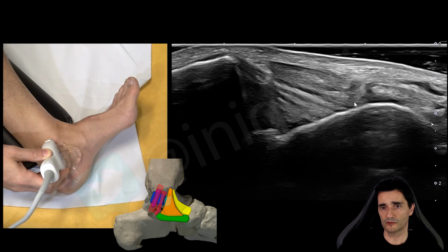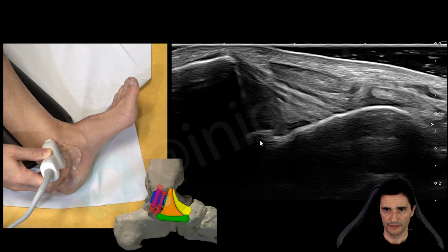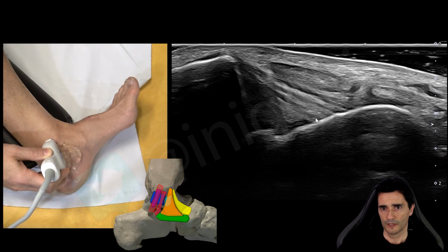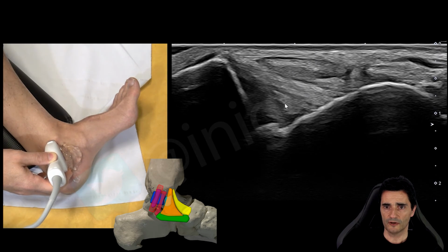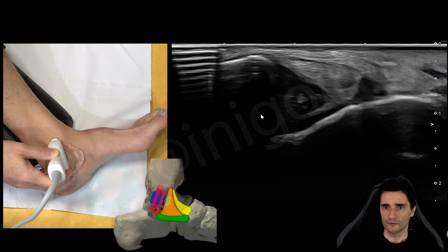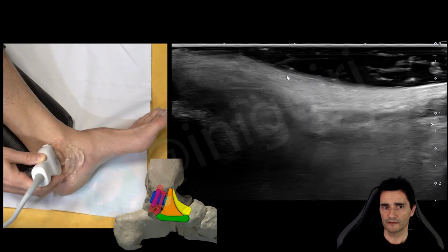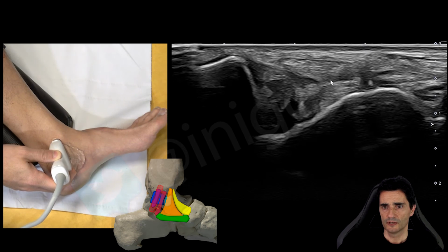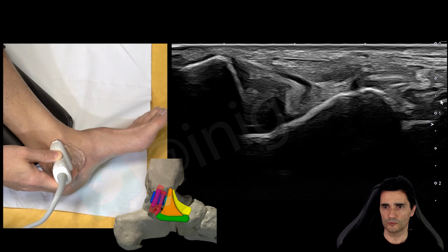And the superficial component. This is the posterior tibialis and flexor digitorum. This is the talus, and this is the tibia. Okay, so this is the characteristic pattern of the posterior tibiotalar ligament. If we continue anteriorly and check the superficial layer, we should see how this layer jumps over the talus and reaches a bone which will appear here.